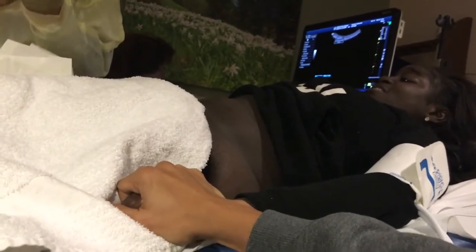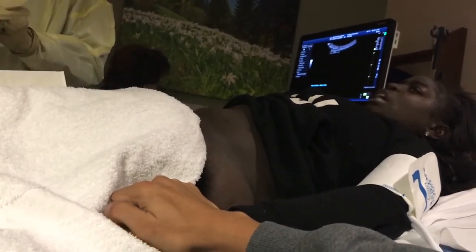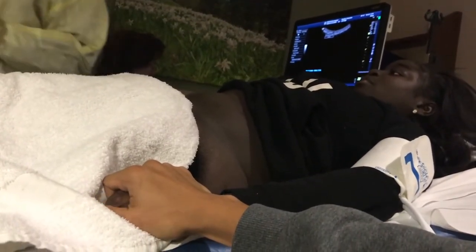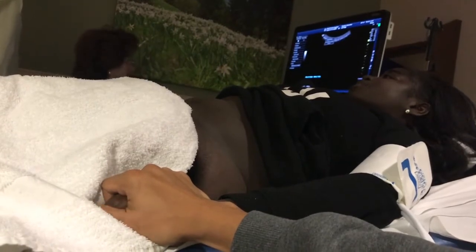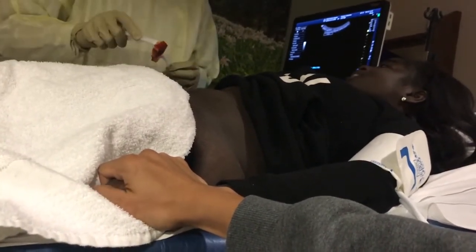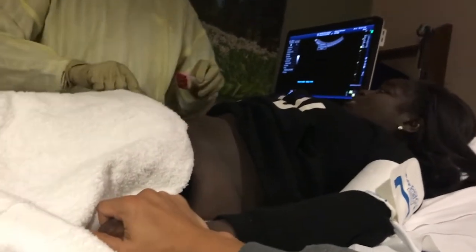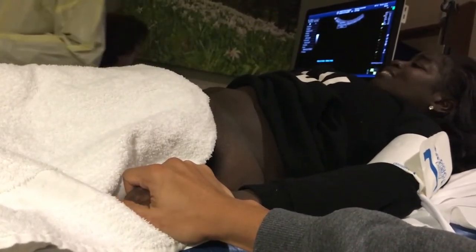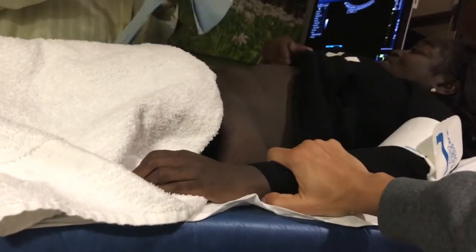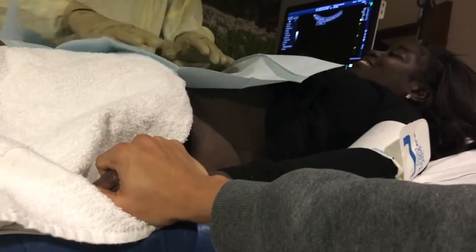Then he preps himself and the area for the biopsy. Once he's marked off the area, he puts on sterile gloves and sterile instruments, and wipes the area down. He covers it with a sterile drape — a covering with a hole placed directly over the marked area — so bacteria doesn't have access to it.